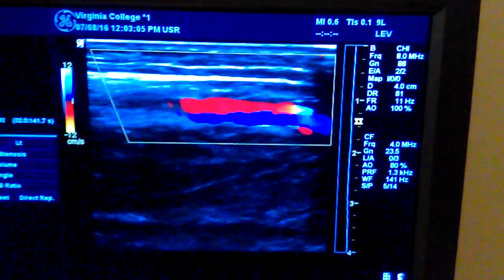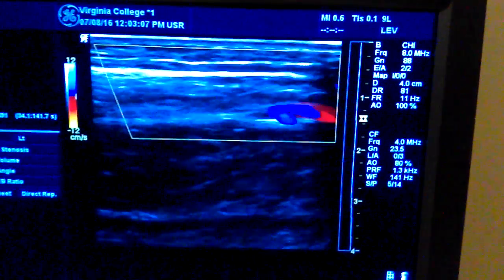Able to get one down here right now, but basically you get the gist. This big old sock right here is probably compressing the veins, but either way you just get both of the veins in and it's fine.